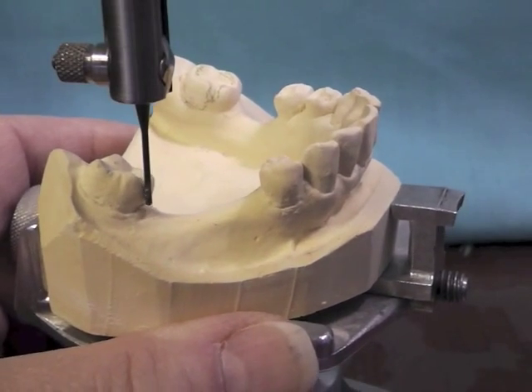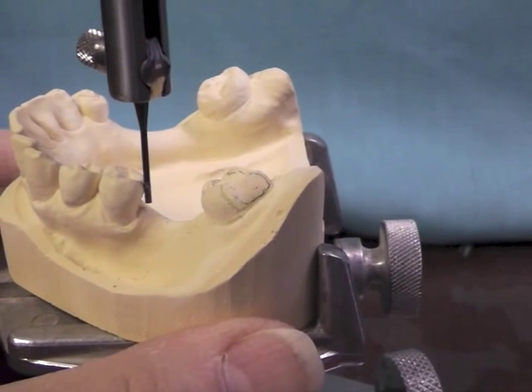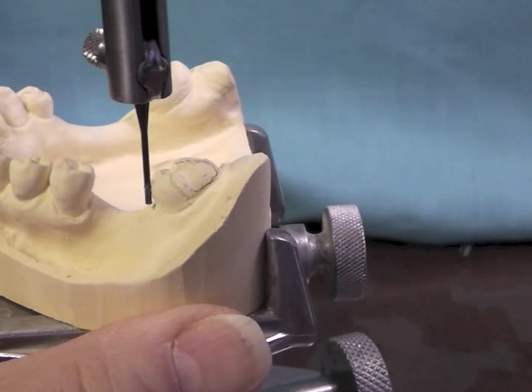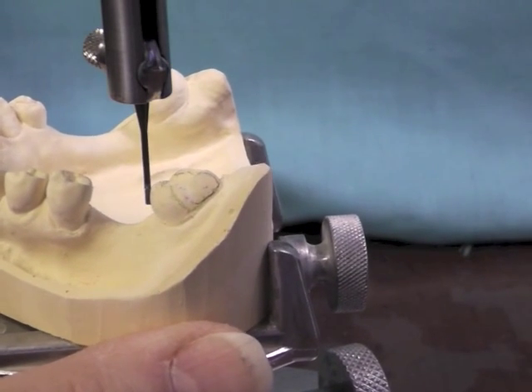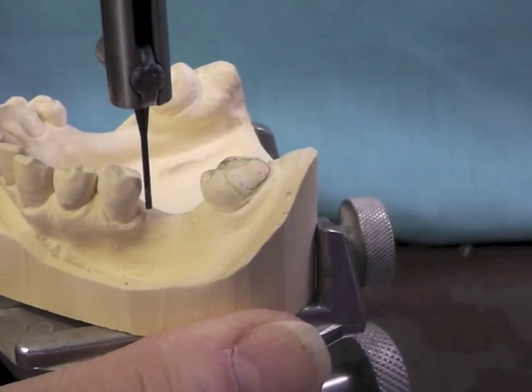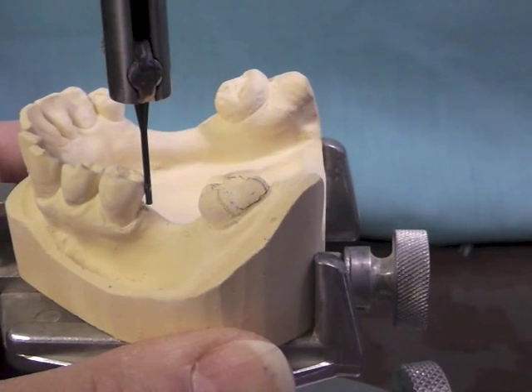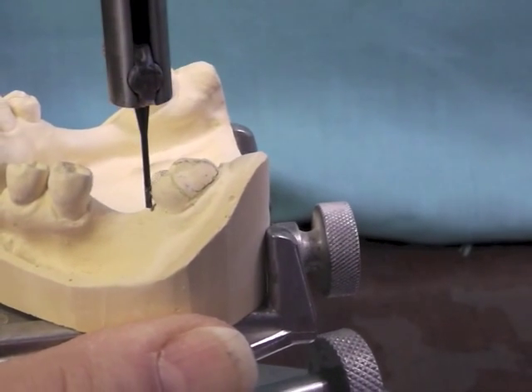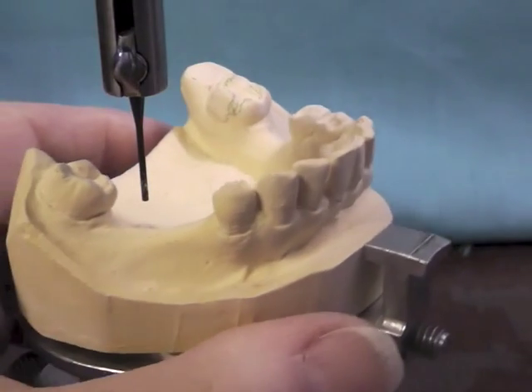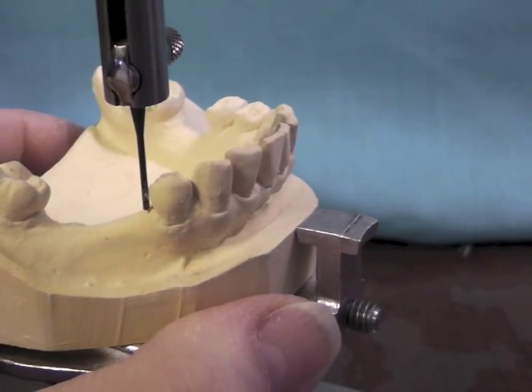So we're going to leave it right about here. I think we're going to be able to do something favorable. But let's look at this other side while we're at it. We have that same situation on that molar, and we've improved the situation where our guide plane will be more advantageous. We might have to take a little bit off of this premolar now, a little bit off of our molar in this area, reduce somewhat on this molar, and maybe touch this a little bit.